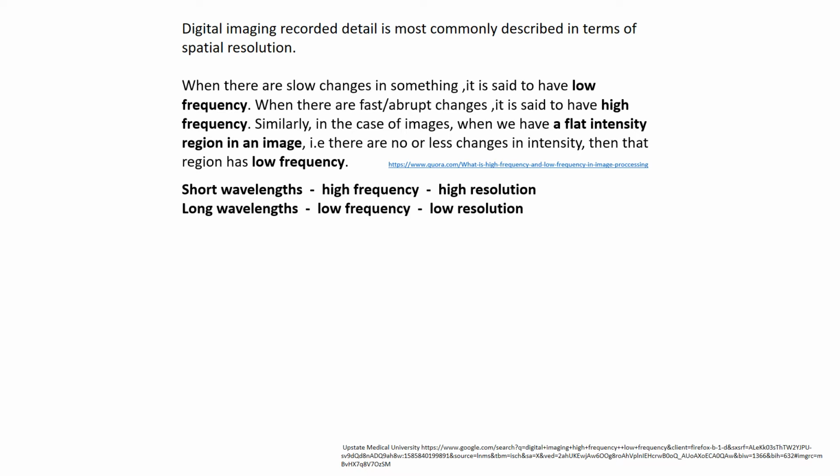Now what are we talking about as far as wavelengths? Well, when the detector intercepts the X-ray photons, it's going to turn them into an electrical signal. And electrical signals travel as waves until they get to the computer. When they get to the computer part of the system, we take these individual waves and look at certain points on the waves.